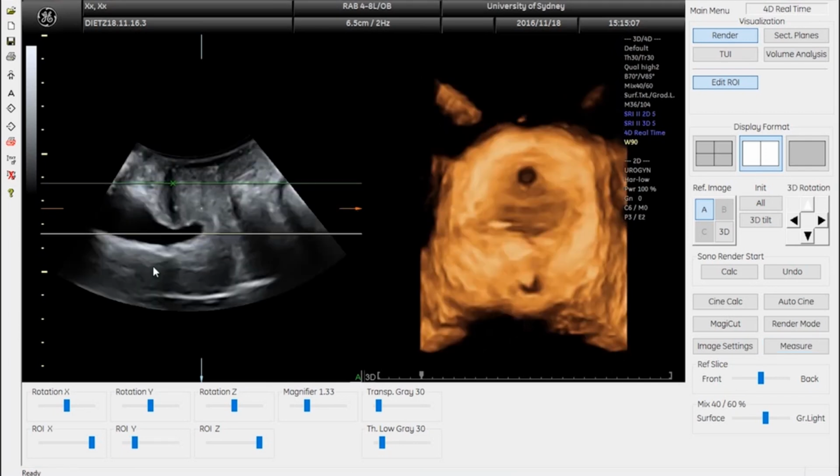I'm going to demonstrate the determination of hiatal area on Valsalva in this lady with a mild 3-compartment prolapse. Here at rest in the mid-sagittal, you can see the symphysis pubis, the urethra, the bladder neck, the trigone, the bladder with the detrusor here, an anteverted normal-sized uterus with the cervix here, the rectal ampulla and the anal canal. Here in the back is the anorectal angle, that is the levator ani muscle.